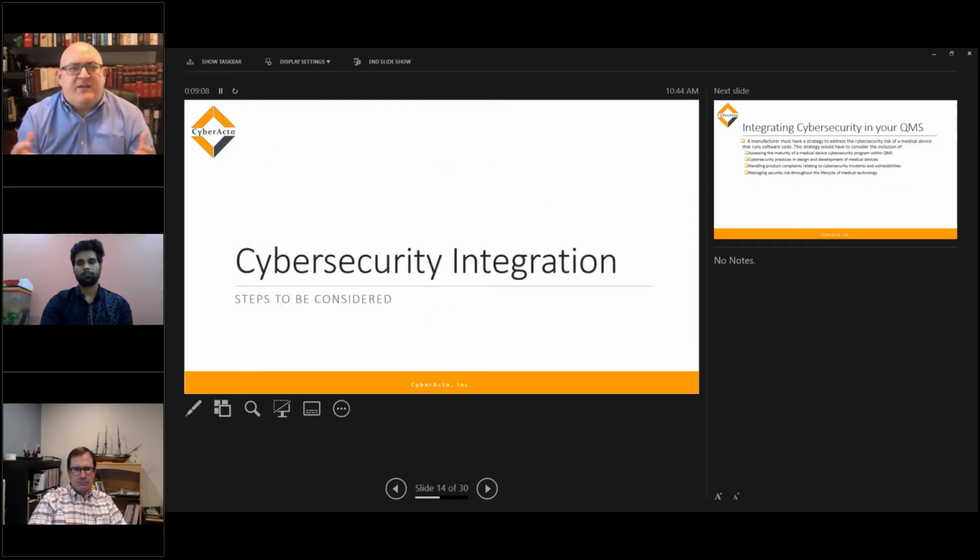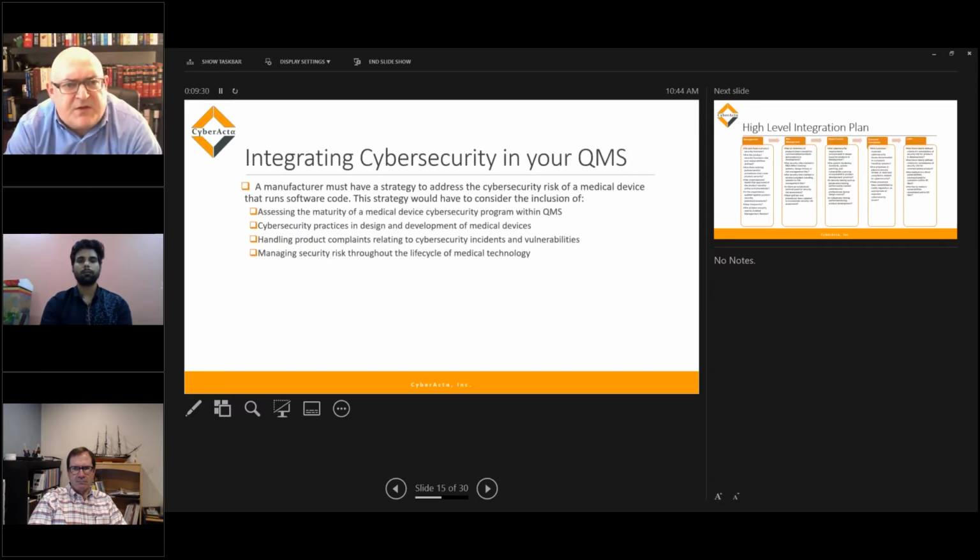Now, from a cybersecurity integration standpoint, this is something that, having done this both in-house and for other firms, it's important to consider. It's not going to be an easy transition, but it's really about how you develop your plan to get there. These are the best practices that we communicate to our clients, and how we help them present to the regulatory bodies.